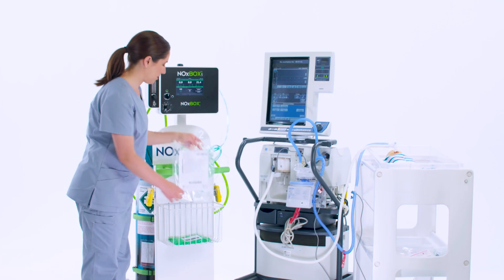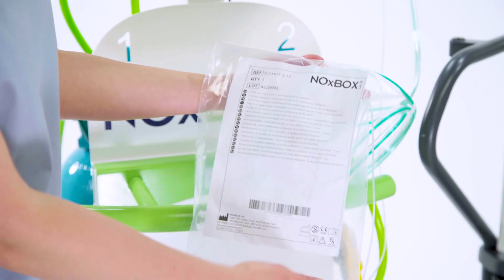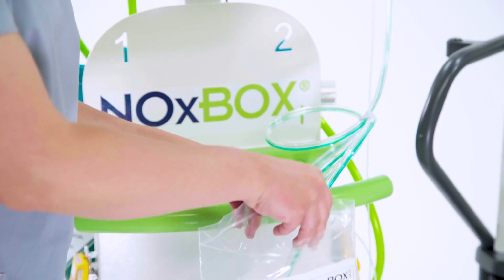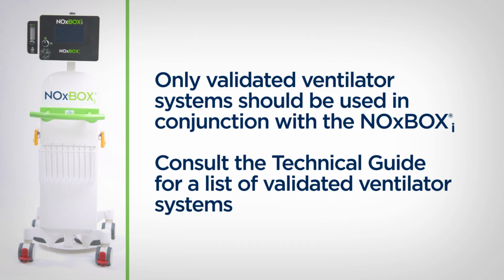When setting the dose, always follow the setting prescribed by the attending physician. First, confirm that you have the correct size NOx kit for the ventilator patient circuit, then connect the NOx flow sensor to the inspiratory limb of the ventilator. Only validated ventilator systems should be used in conjunction with the NOxBOXi system.